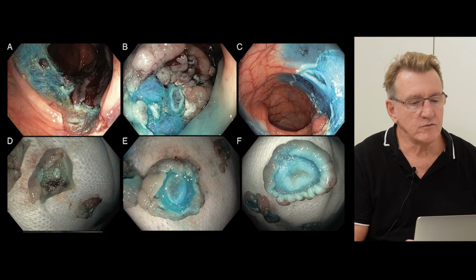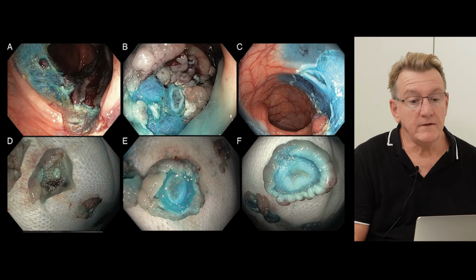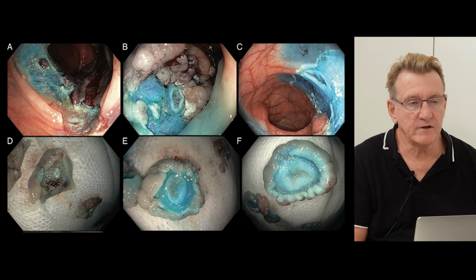But if the whole defect is bigger, catch the muscle. With maybe small clips here even, no? Yeah, you can downsize, perfectly. Okay. Yeah. So that's the main message. Watch out for type 3.